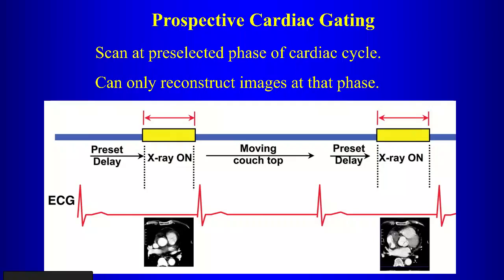Coronary artery CT? 0.625, right? So when you're doing coronary artery CT, we look at it at the minimum slice thickness we can obtain, which is 0.625 millimeters on our particular scanners, right? When we're doing coronary artery CT, coronary CTA, right?